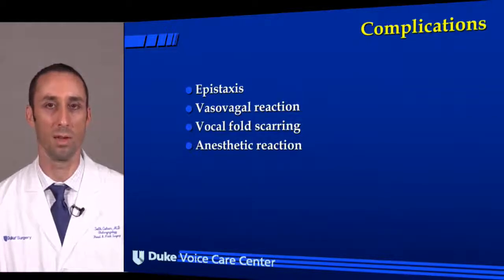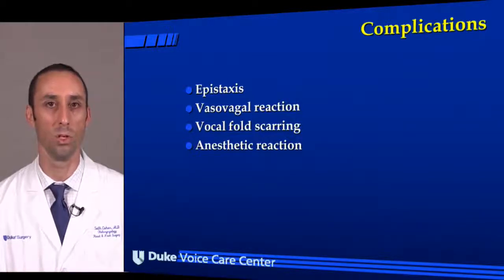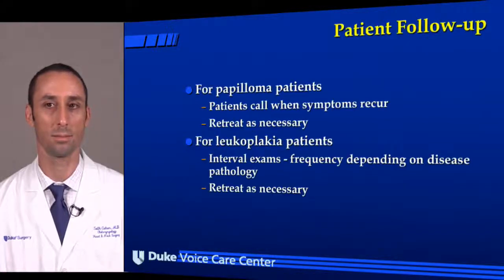You could have an anesthetic reaction. So it's very important to monitor and always double check with your nurse who draws up your lidocaine. Make sure you see that bottle, make sure that there's no epinephrine in it, make sure they don't have any allergies to lidocaine, and make sure that you are calculating in your head the amount of lidocaine that you are giving.